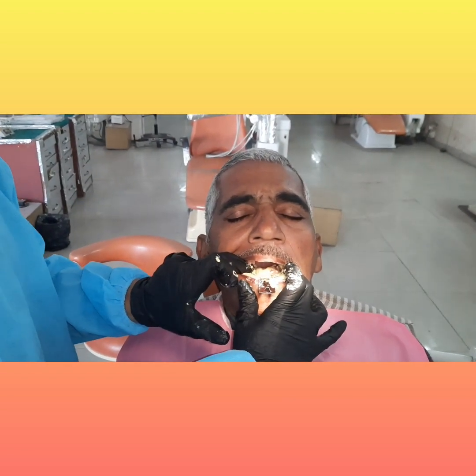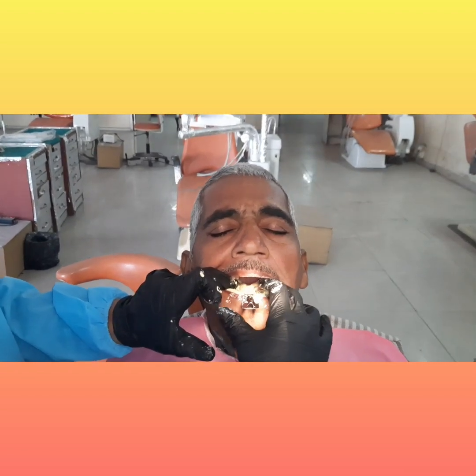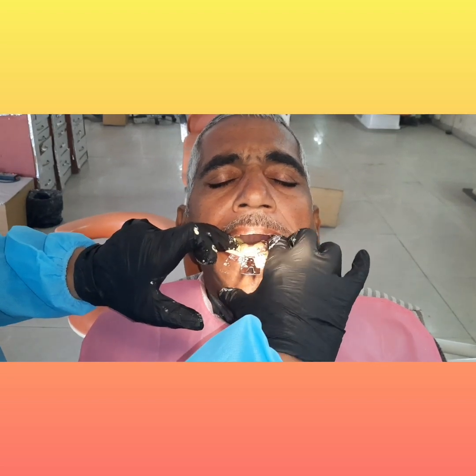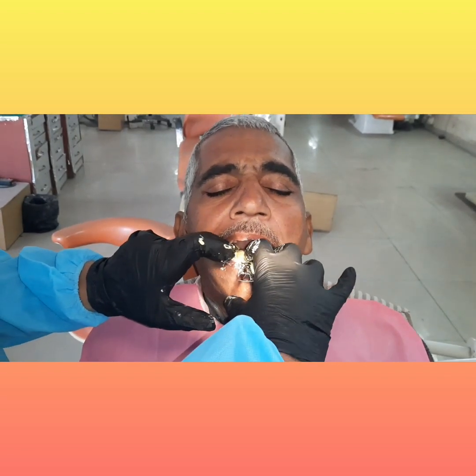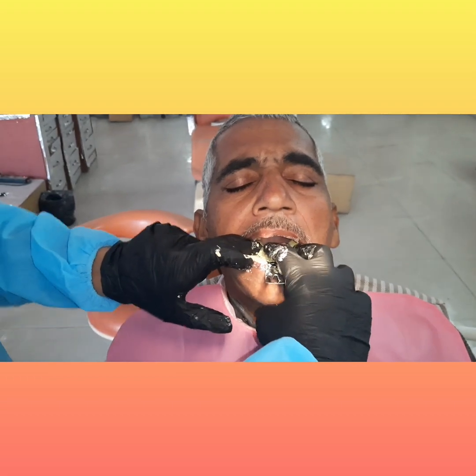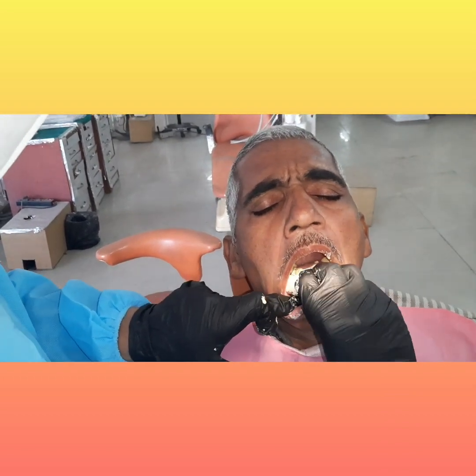When you mix the powder with the liquid, it forms a sol, and then the sol converts into a gel. Once it converts into a gel, that is the time to remove it from the patient's mouth. To remove it, you must remove it in one snap — because if you remove it slowly, there are chances of tearing. Alginate and agar materials, being hydrocolloids, have poor tear strength. Break the seal if any, and remove it in one snap.